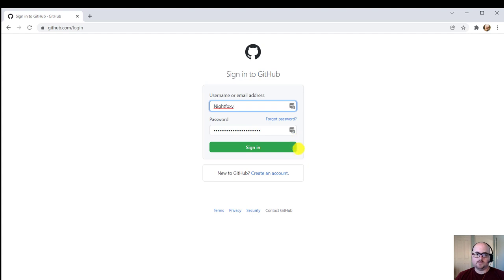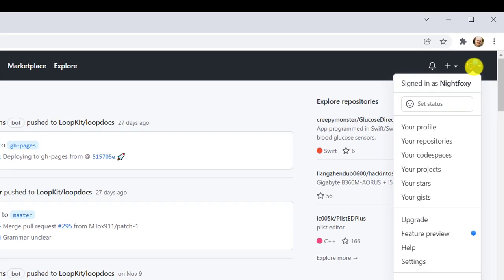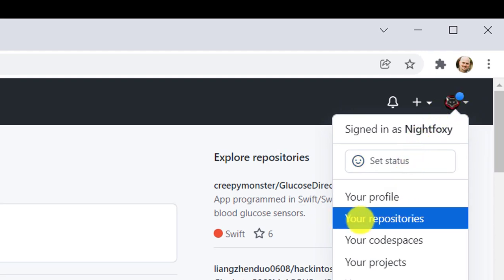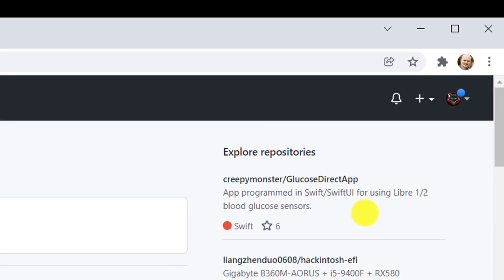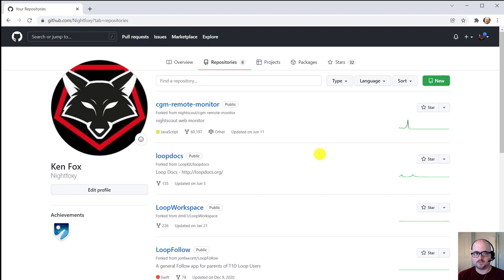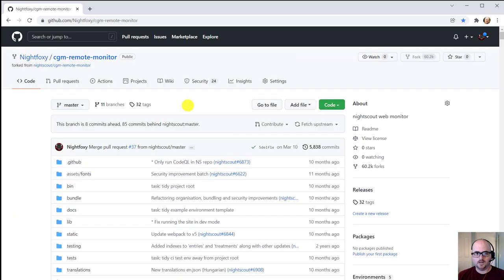From here, you can log into GitHub, click on your profile image, and go down to your repositories. This will list all the ones that are yours. Find the CGM remote monitor and go ahead and click on that.